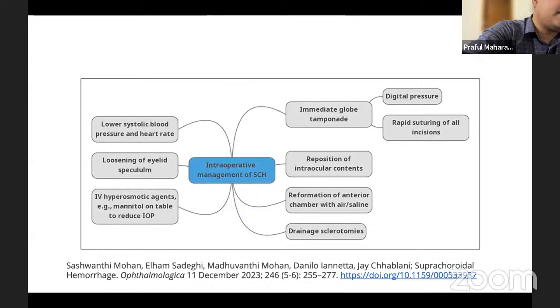When I was a senior resident, in one of my cases, a pediatric PK with a failed Peters, one of my consultants had a suprachoroidal hemorrhage. And there we couldn't, 10 nylon was not holding at all. It was breaking. So we had to put 8-0 Vicryl to fix, to form the chamber and close the eye with the new graft.